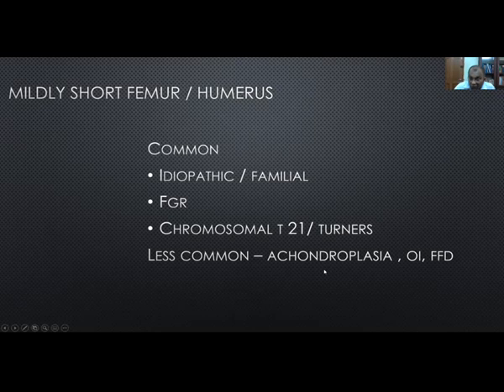Less common causes in the 20-week scan: achondroplasia will be really mildly short, and osteogenesis imperfecta, as I mentioned.